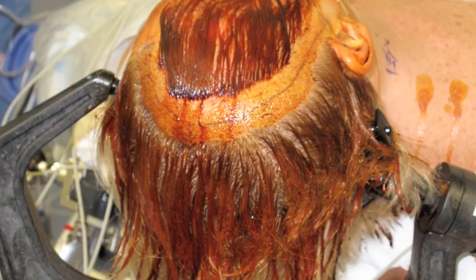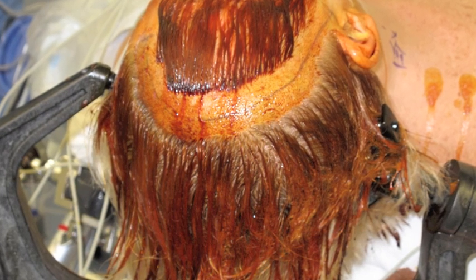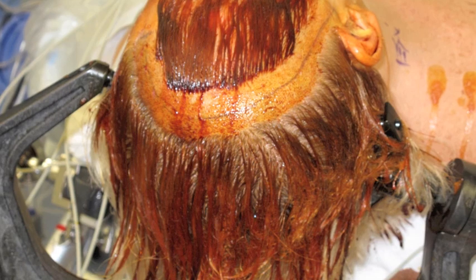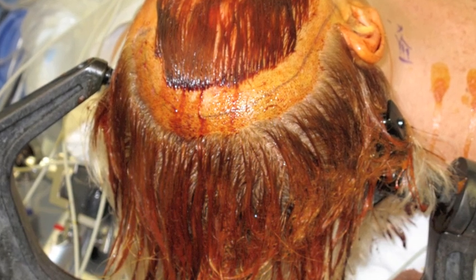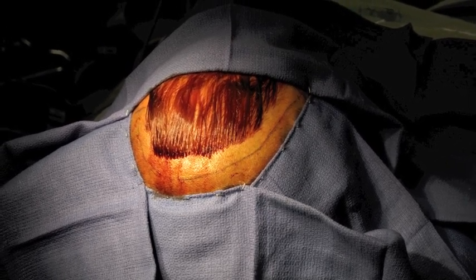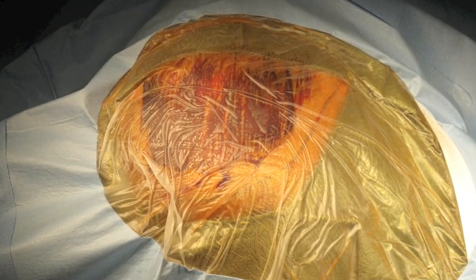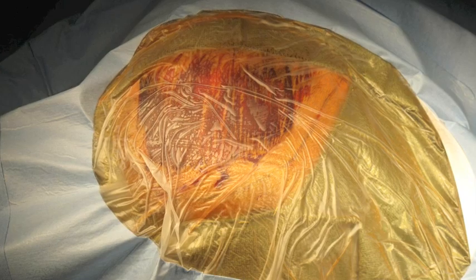Perioperative antibiotics are administered and the frontotemporal region is then shaved with a skin incision marked from widow's peak to the zygomatic arch. The surgical field is then prepped and draped in usual fashion including sterile towels, Ioban, and a craniotomy drape.